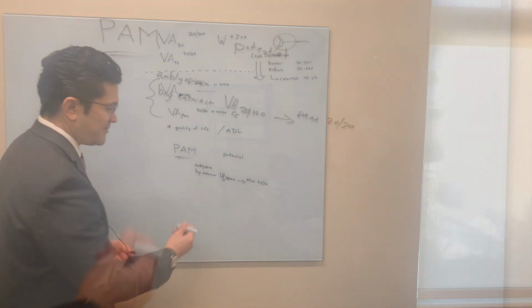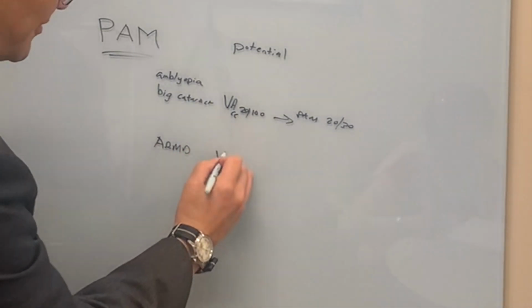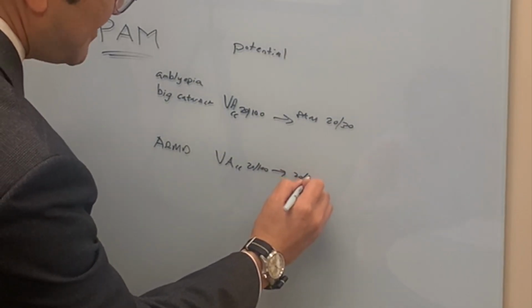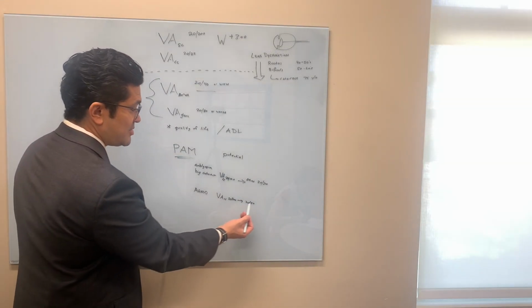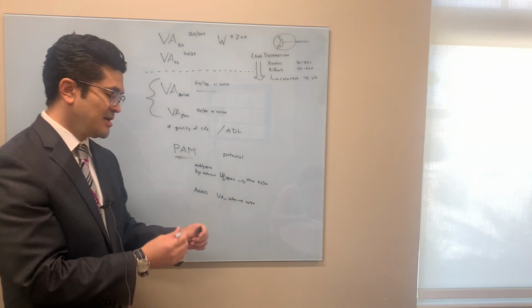So it's a good way to help guide the patient through prognosis. PAM can also be helpful for your macular degeneration patients. Let's say your vision was 20/100, but our PAM only gets them to 20/50. So now we can counsel the patient, well, it's going to help you. Cataract surgery will get you only to 20/50, though. At least that's what we're predicting.